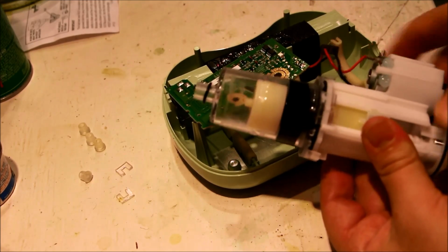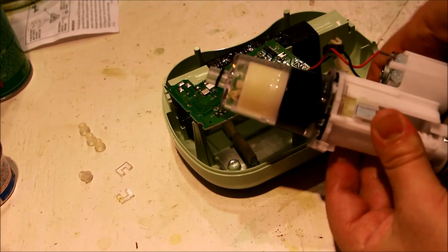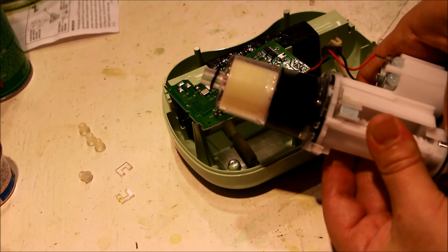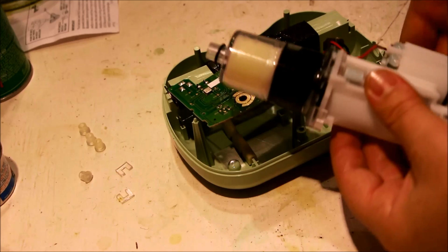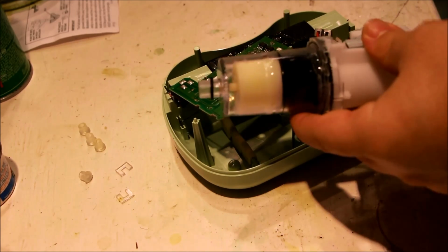And as the pump goes, the pump turns like this, and it probably is going at a fairly high rate of speed, back and forth and back and forth, but as the pump extends all the way out to the end here, it opens, and hopefully you can see that, open, close, open, close. So it's got to be losing suction somehow. One way or another, this is not as efficient as it could be.